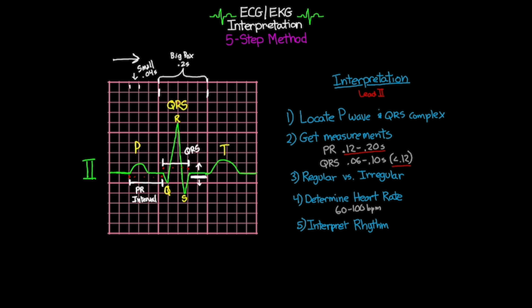All right, I hope you guys followed along with all of that. I hope that I was able to explain these different concepts in a way that really makes them understandable for you, because it's really important that you guys are able to look at your patient's rhythm strip and be able to make a determination of what's going on, because sometimes depending what you see, it may require urgent or emergent intervention, and you being able to catch that and get somebody on the phone or get somebody to the bedside in order to address it can really make the difference for your patient.